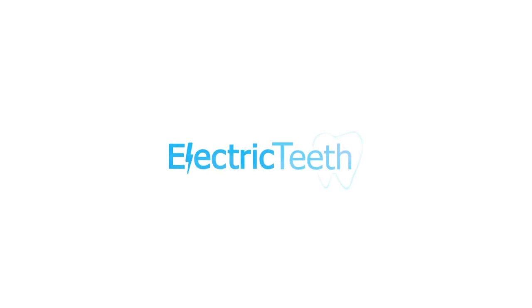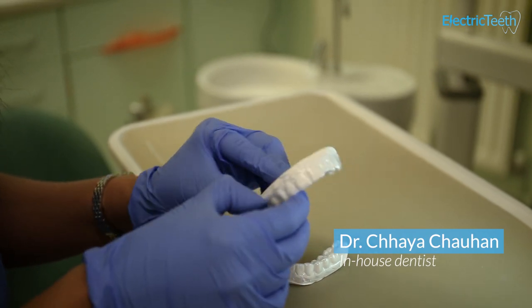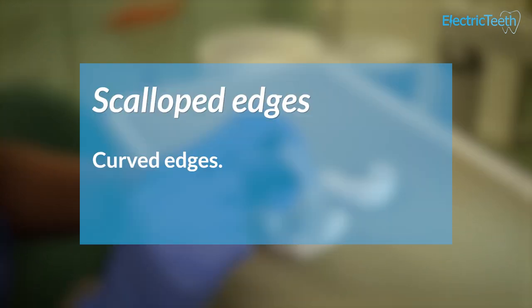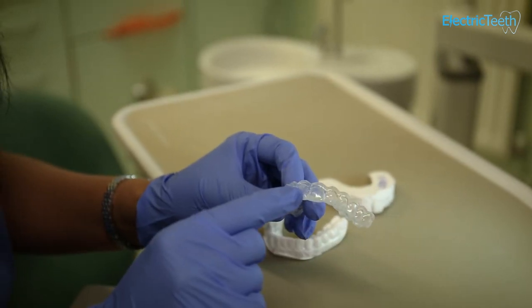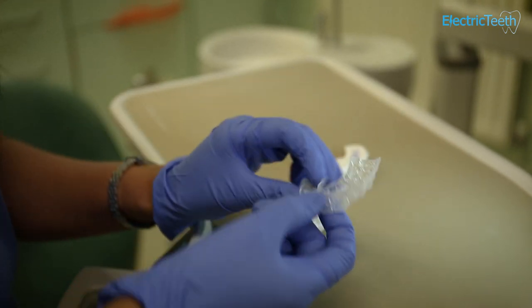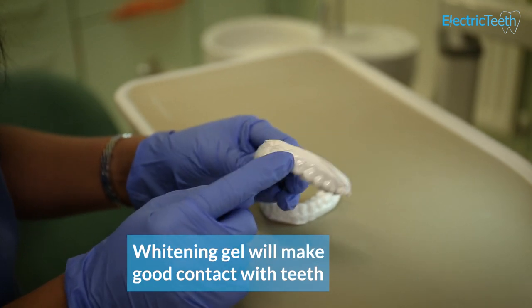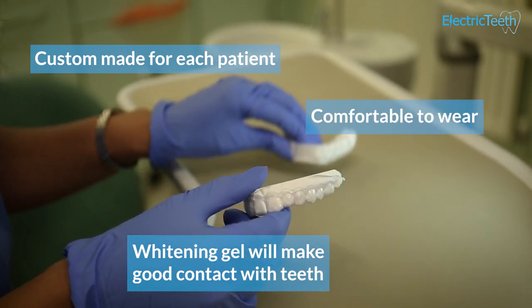This is a set of custom-made whitening trays. We've had an impression taken of a patient and they've had some trays made of their teeth. As you can see, the trays have got very comfortable scalloped edges. You can see each individual tooth which is custom-made to the shapes of the patient's tooth. Once these trays are worn inside the mouth, that gel is not going anywhere — it's going to have really good close contact to the teeth. It's not going to be mixing in with the saliva and it's going to be quite comfortable to wear.